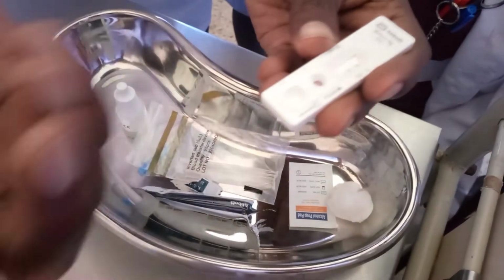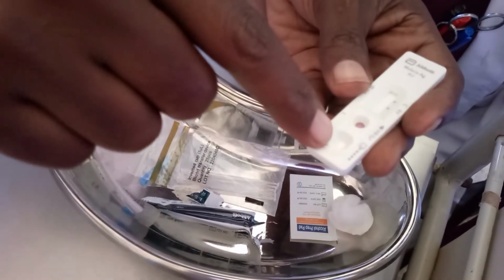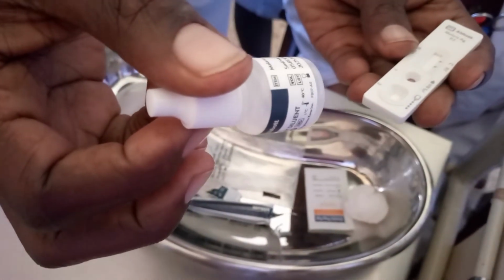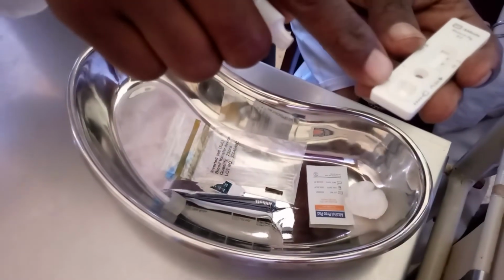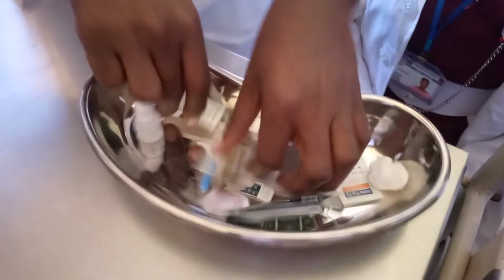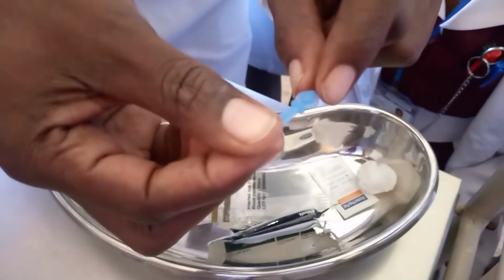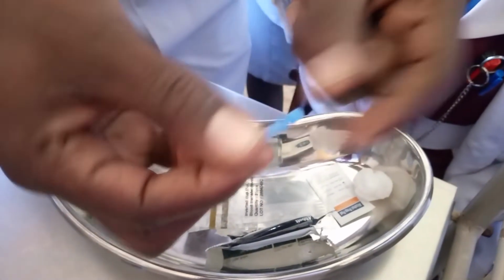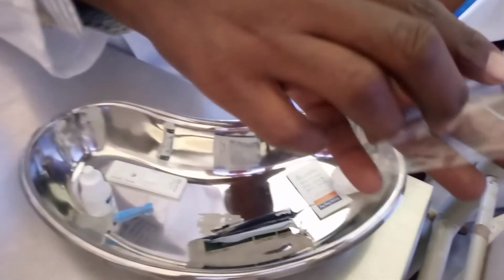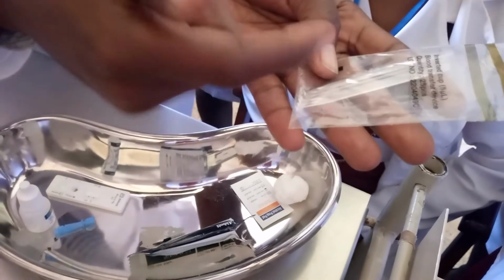Then you're going to drop blood on this port where there's this dot for blood. Then here you're going to put a diluent. This comes with a diluent, which is here. I'm going to put about 2 drops of the diluent here so that it mixes with the blood. Other things that you have: this is the lancet for pricking the patient. We're going to remove this piece of plastic so as to remain with the needle cut. Then here, as you can see, is the inverted cup, or blood transfer device. We're going to scoop blood using this device.